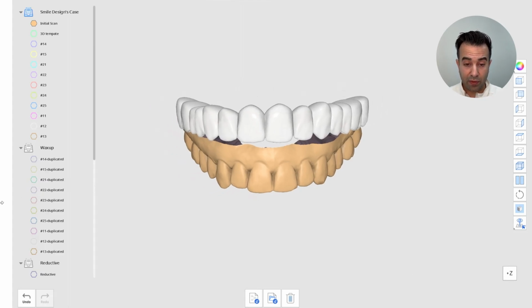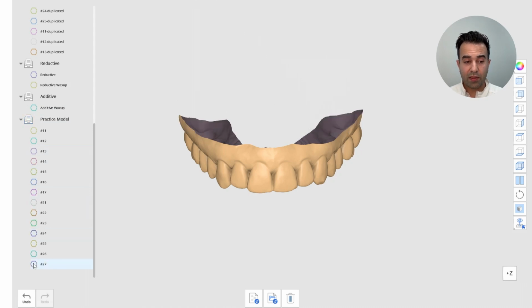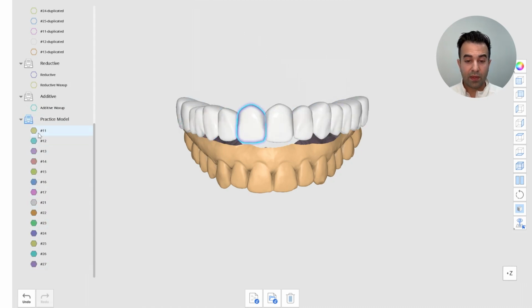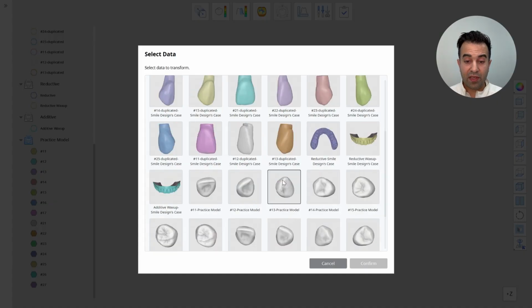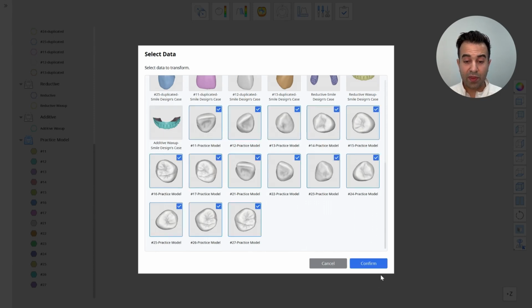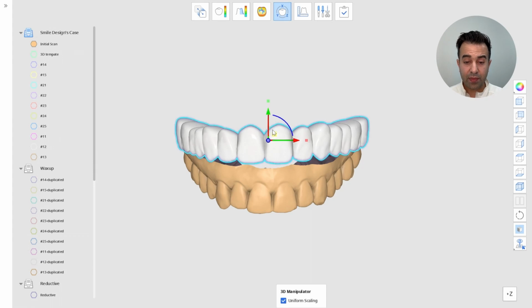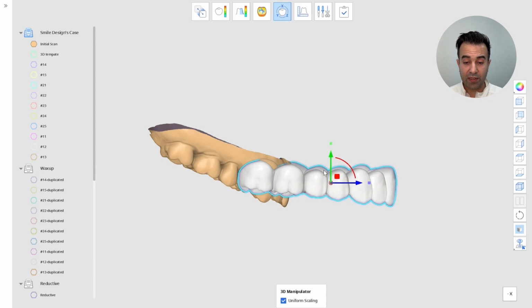And that was the webinar of the previous one. Step 1 was importing a 3D teeth library, and one step is done. And the second step was using the transformation mode to scale and position these 3D teeth library in a favorable position within the arch. And that's how you can customize your 3D teeth library for all your cases.